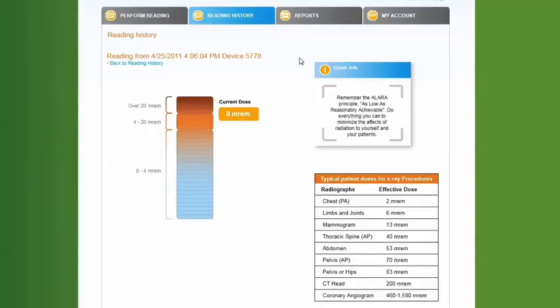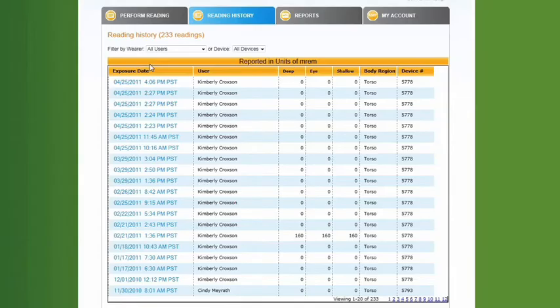Once complete, a graphical representation of the current dose will load on the screen. A user can then click Back to Reading History to view a detailed list of when a device was read and what the exposure levels were.